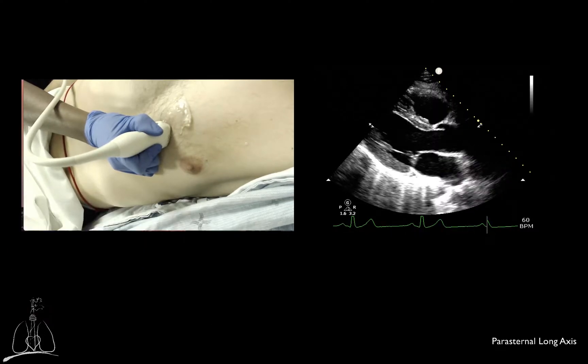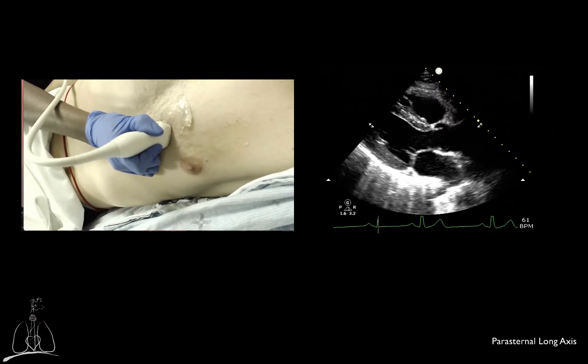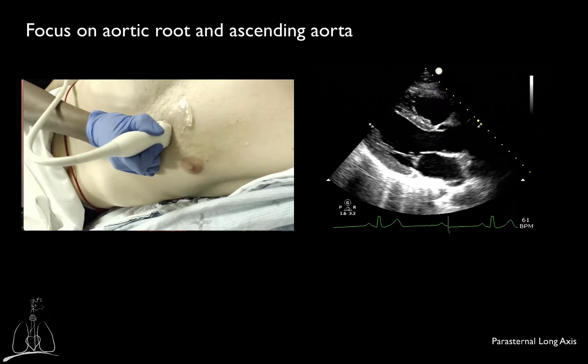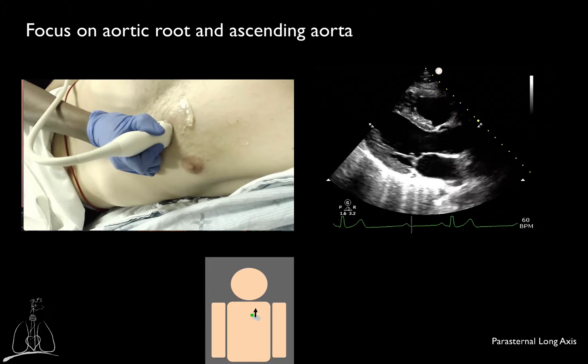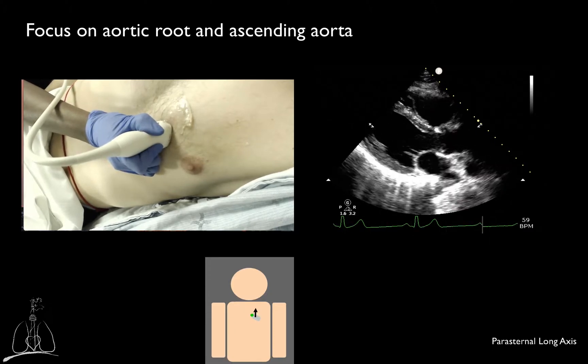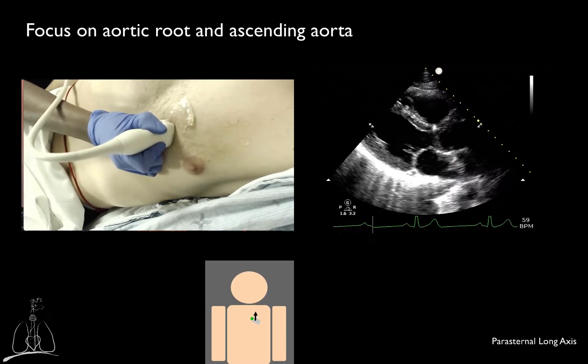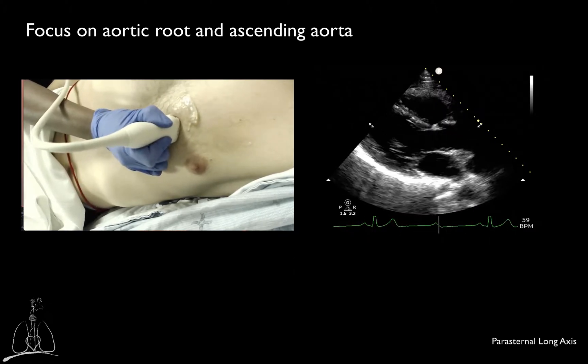When focusing on the aortic root and ascending aorta, the transducer should be slid superiorly, usually one intercostal space higher.